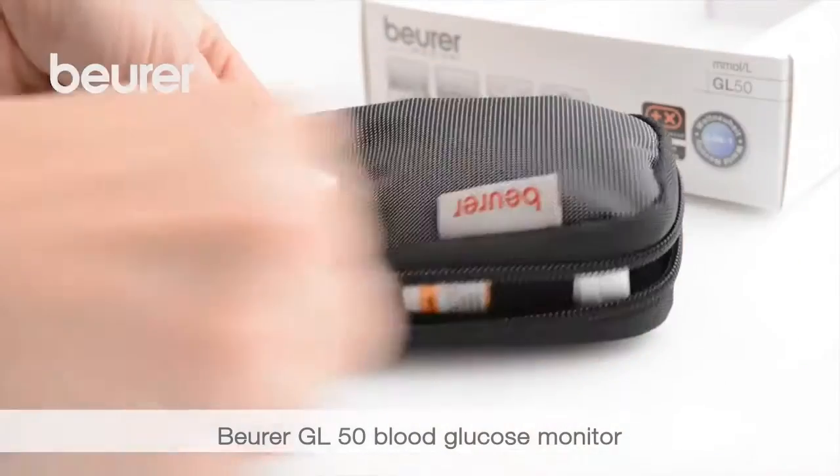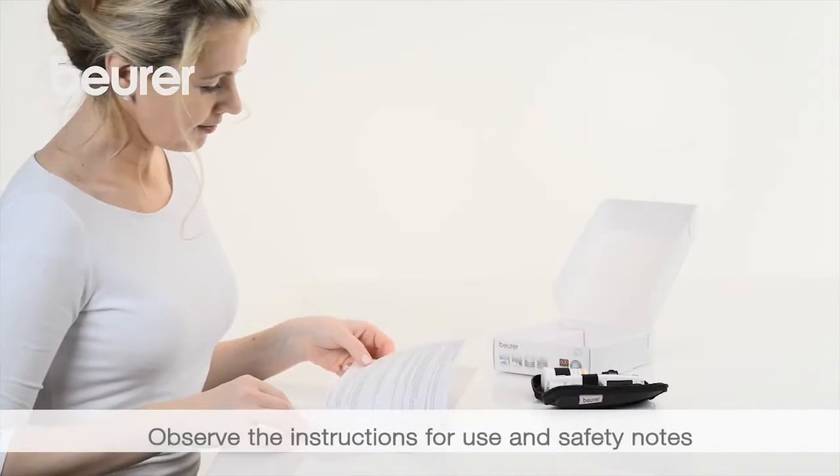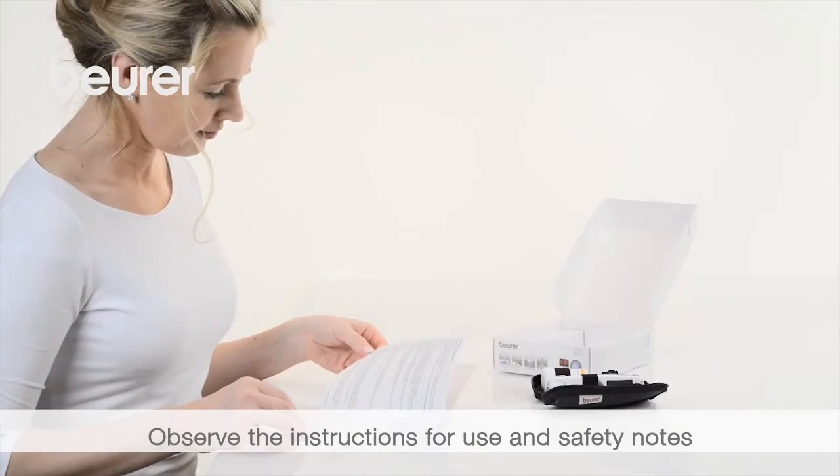This is a guide to the correct usage of the GL50. Pay attention to the instructions for use and safety notes.